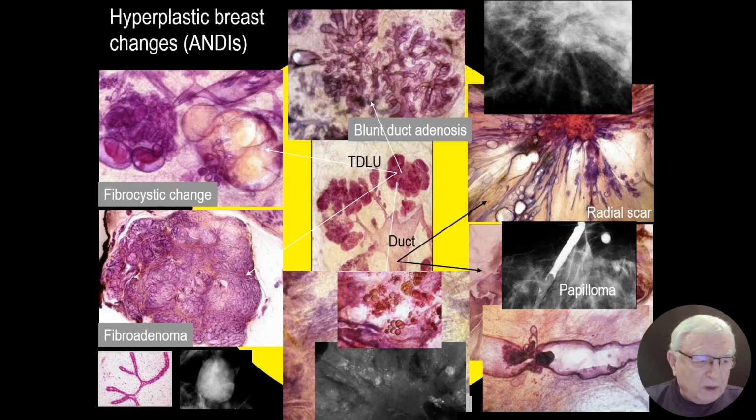What are you doing when she comes with serous or bloody nipple discharge? Oh yeah, I just do this periareolar section and then I take a little piece of tissue out. Whoops, I just missed the papilloma. What doesn't matter because I put a suture here. So the symptom is going to disappear, but the disease is laughing at you. We'll talk about this as well. I encourage your radiologists, introduce galactography in your country.